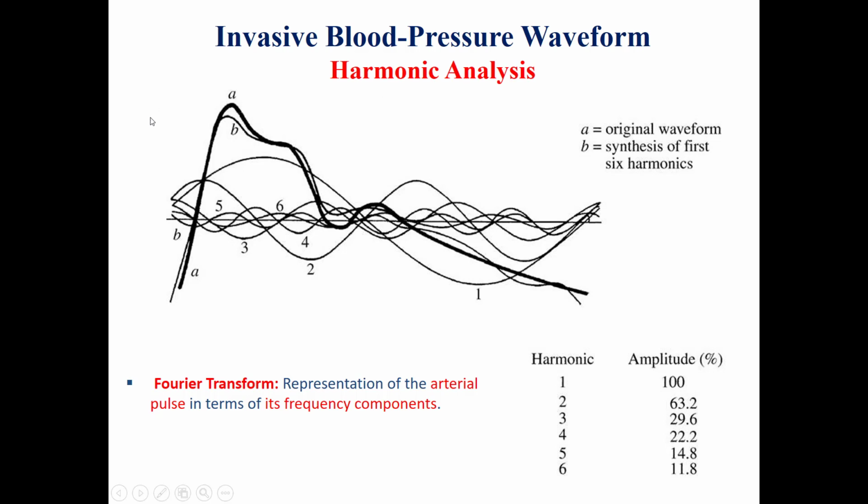So, as we can see, this is the arterial blood pressure wave, which is a periodic signal, which can be made using a set of superimposed sine waves with different amplitudes. So this means that this wave will be the input through a line.